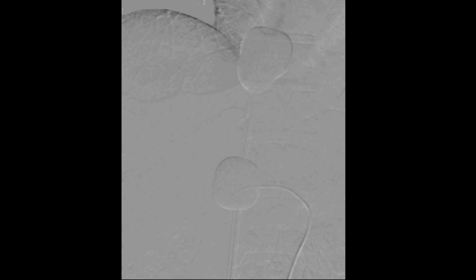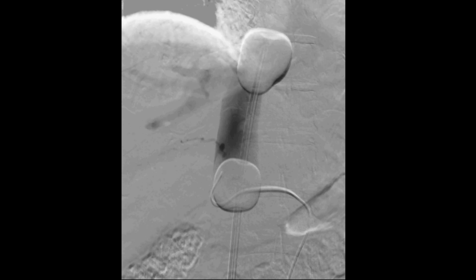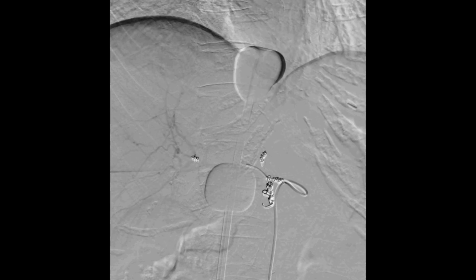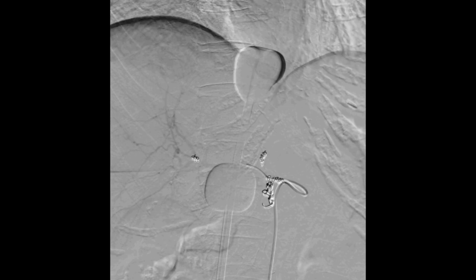So all of this dye is then isolated into that small area between the two balloons, and the blood is leaving the body through this tube down here, out to the groin and through the two filters, and then it's returned back to the body itself. And this is me then starting to infuse the chemotherapy through the artery with the balloons in place. It means that I'm isolating the liver from the rest of the systemic circulation.